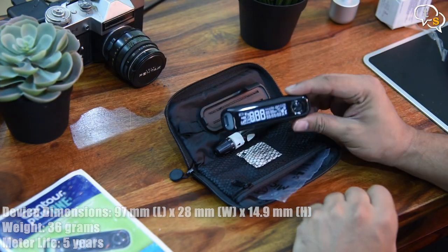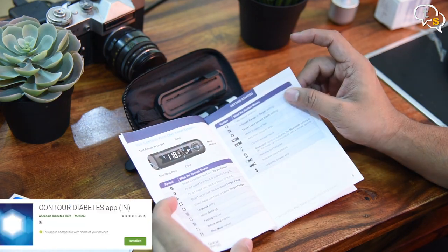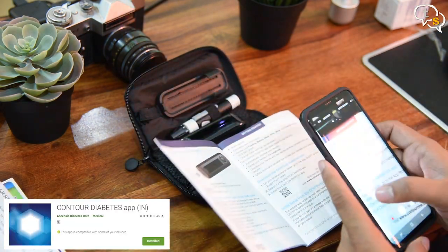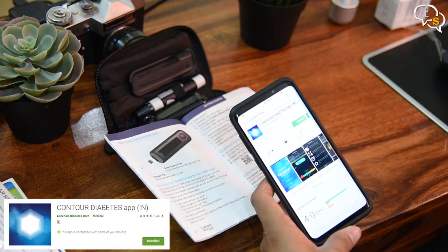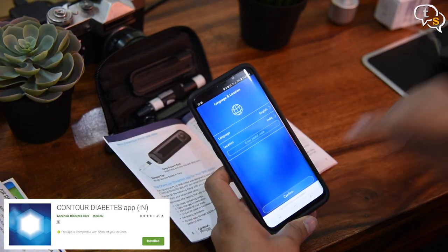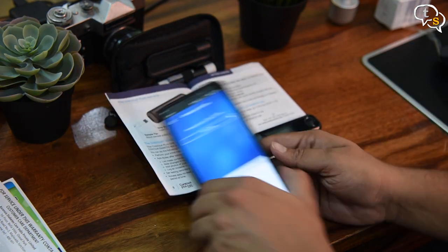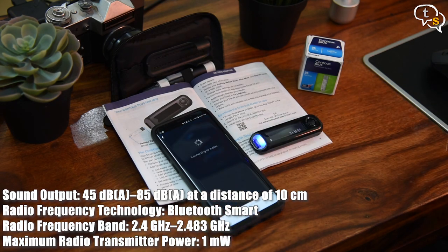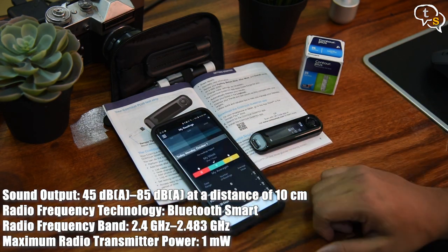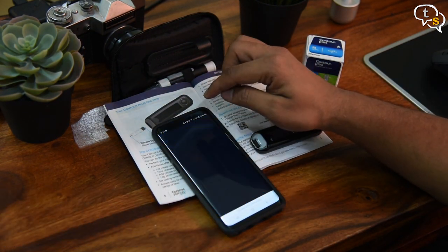When you turn the device on for the first time, it prompts you to set the date and time. A QR code is present in the manual for the Contour app, which can also be searched for directly on the Google Play Store. Install the app and create an account. Within the app, we need to pair the device — turn the device on and it enters pairing mode. The phone finds the device and it is ready for use. I felt this device is meant only for a single user as I couldn't find a way to store multiple user profiles.